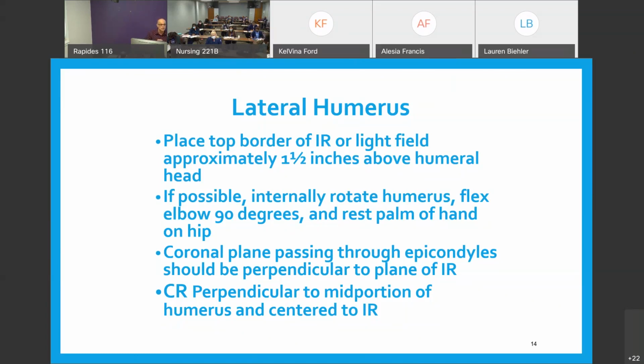Stop breathing is different than hold your breath. Don't you think? Because when I say hold your breath, patients have a tendency to want to inhale first. It's like taking a deep breath and hold it. We didn't say that. That's a chest, right? So we could build off of that for a chest x-ray. Take in a deep breath, blow that one out, take in a much deeper breath and hold. This says suspend. Just stop where you're at. And my thing is stop, hold still, don't move, hold still, don't breathe, beat. Breathe and relax. That's what I want to hear because you're hitting all your marks that you need for that lab test. All right.